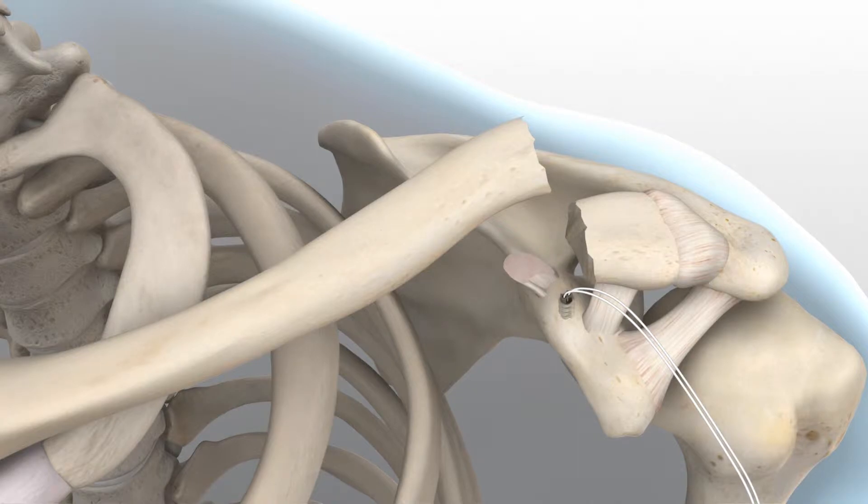Select the appropriately sized locking clavicle plate from the different lengths and curvatures provided in the system. The surgical technique from this point forward will highlight a locking distal clavicle plate utilizing eight 2.3 mm screws.